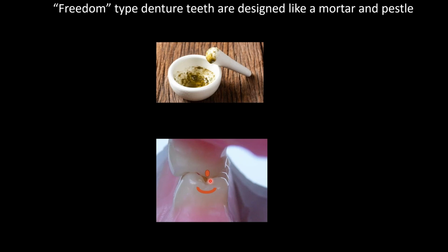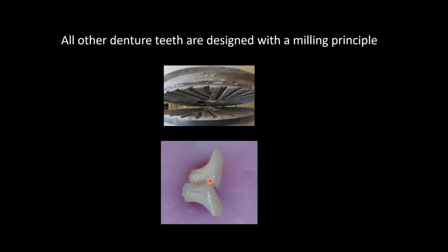I would like to tell everyone, and I'm going to put it on record because this is being recorded, that I have eliminated the complaint of "I cannot eat lettuce" from my office ever since I switched to lingual-formed denture teeth. They've been on the market for what, 15 years or longer? Jim would probably remember that better than me. Gone is that complaint because this is mortar and pestle. This stuff crushes food. I don't get that complaint anymore because it works. This is mortar and pestle.